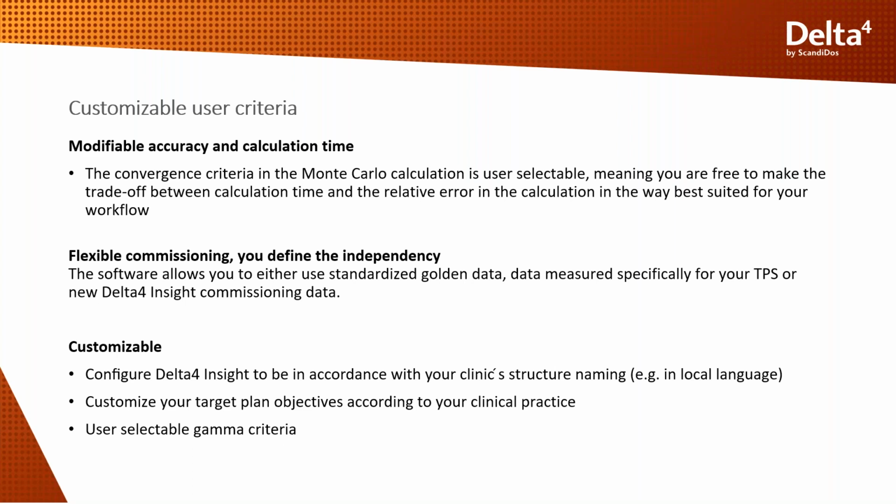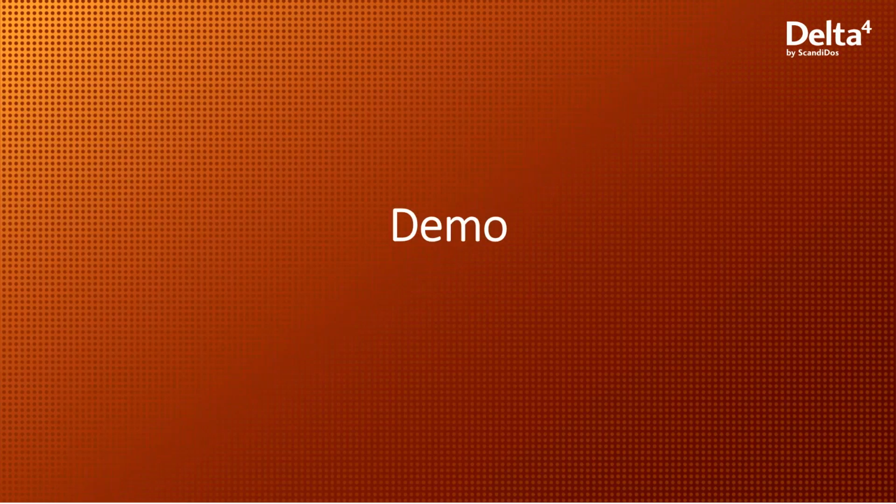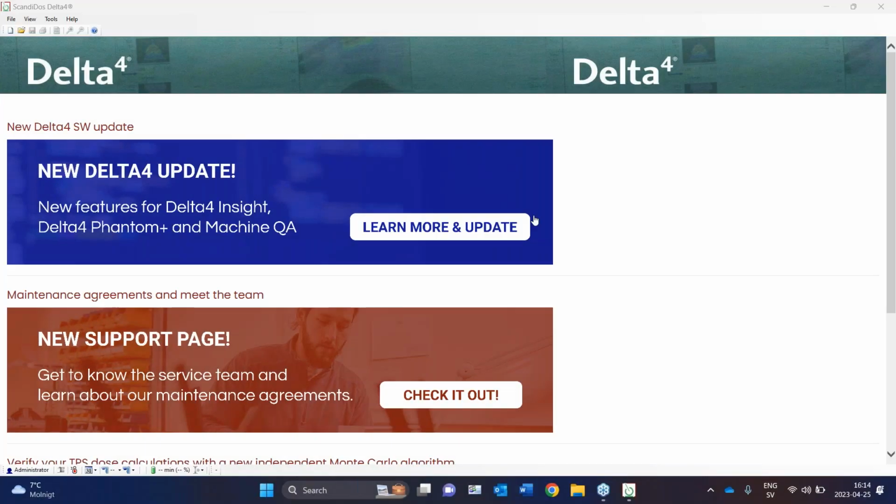And with that said, I will hand over to Madeleine for a demo. Perfect. So I hope everybody can hear me and see my screen. And I will demo this software for you now that you've heard about it.